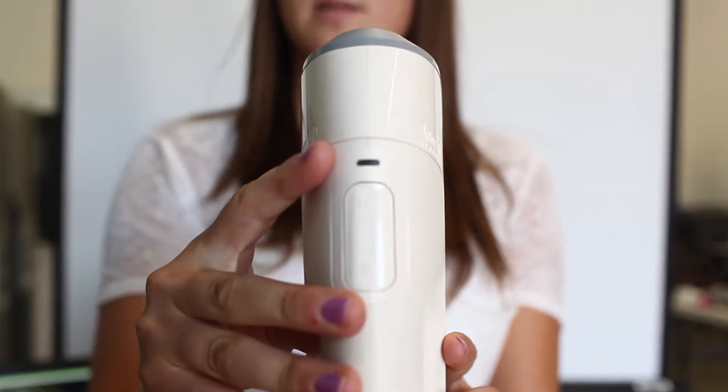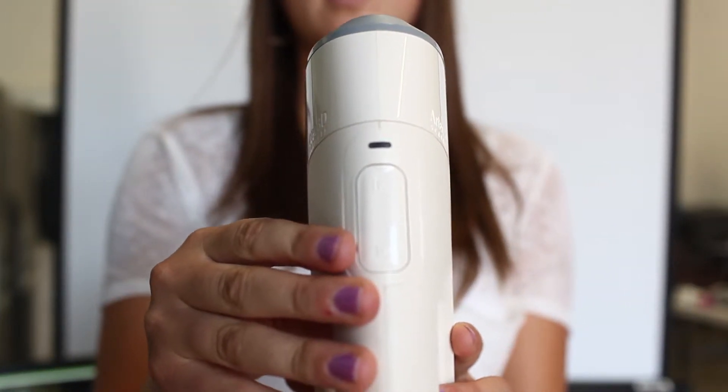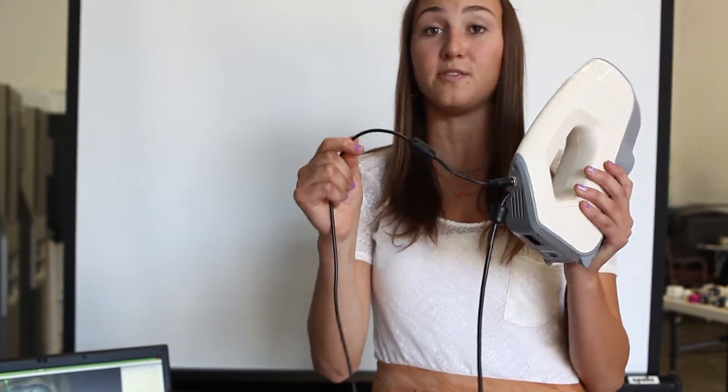Now these scanners are very light, simple, and easy to maneuver. They also have very simple buttons such as the play button and the stop button. In addition, they're also very easy to plug into the computer because of their USB port.